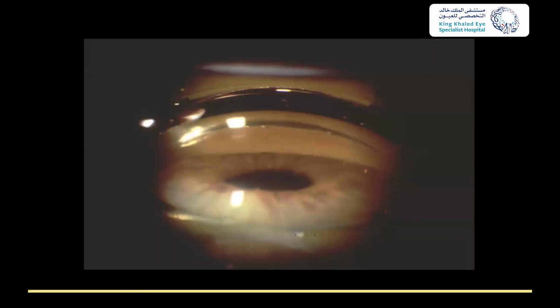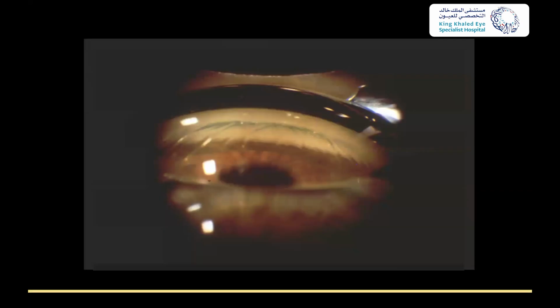So this is somebody with a very, very narrow angle. When I push, you can see the trabecular meshwork. So this is somebody whose angle's not closed with synechia, but closed with apposition. And again, you see corneal folds there. This patient has this sort of stuff over here. We don't know what that is.